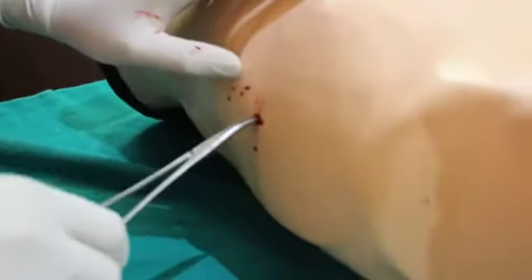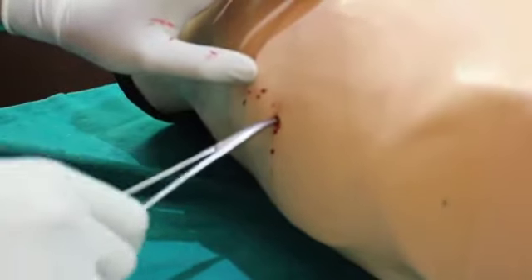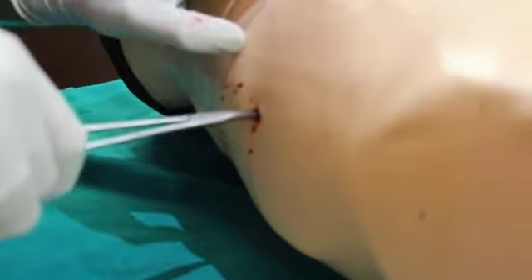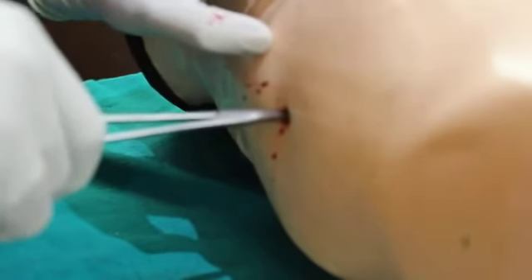Dissect and dilate. And then puncture the pleura. When you puncture the pleura, you will get a give-away feeling or you get a pop sound.